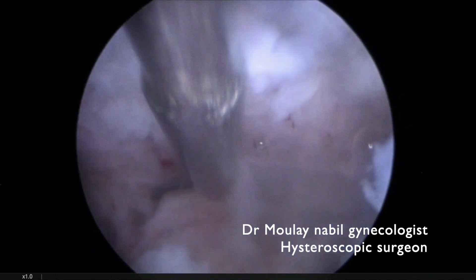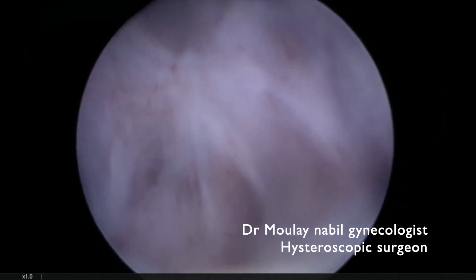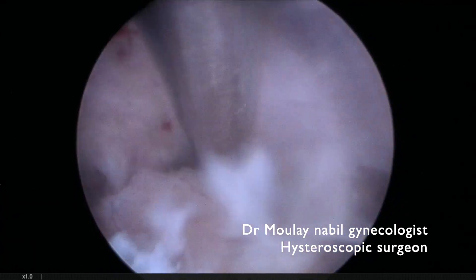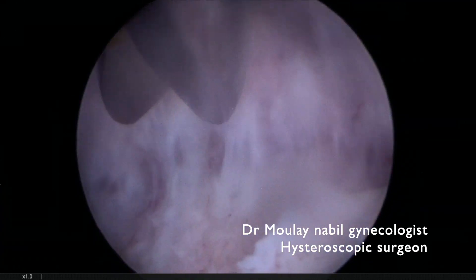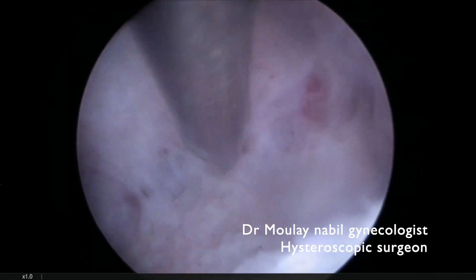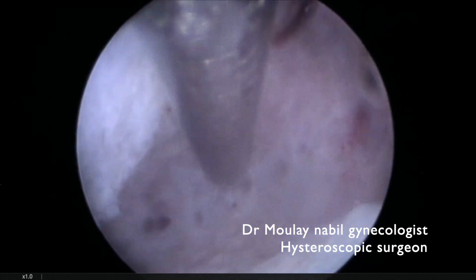Even though we cut on the right lateral aspect of the uterus, we do not find the right tubal ostium. You can see the artery, so we have to stop the section.